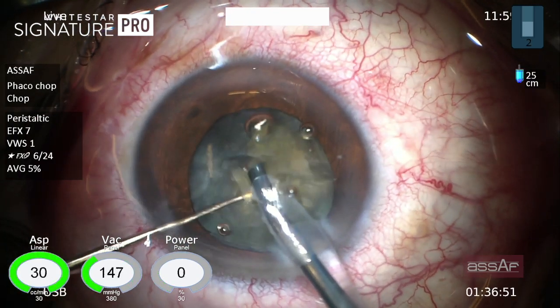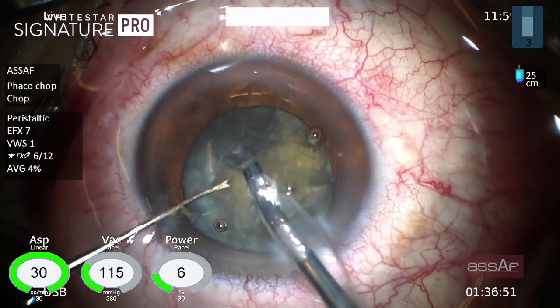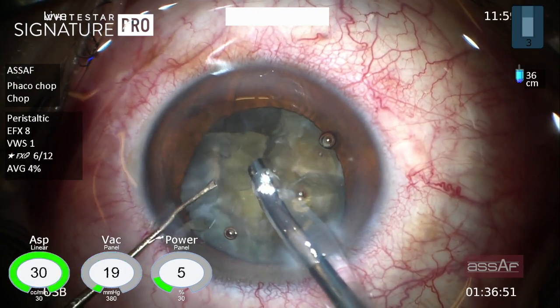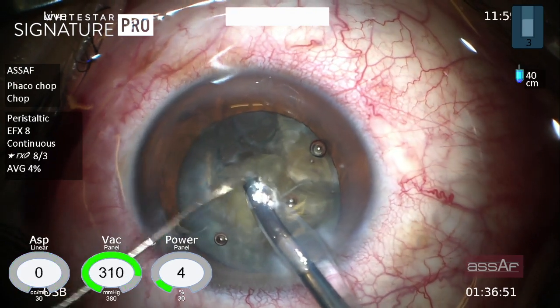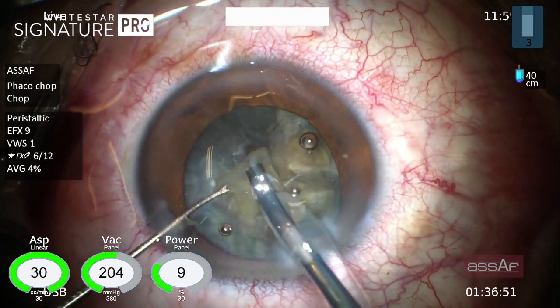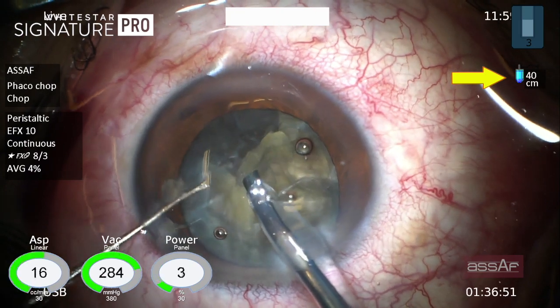After dividing the nucleus, we can move now to the next phase, which is the quadrant removal phase. I'm pulling each free fragment outside the lens capsule for emulsification in the supracapsular plane. At this stage I increased the bottle height to 40 centimeters for better stability of the anterior chamber.